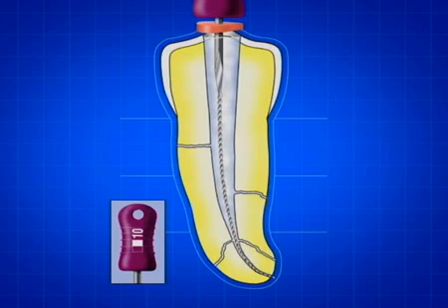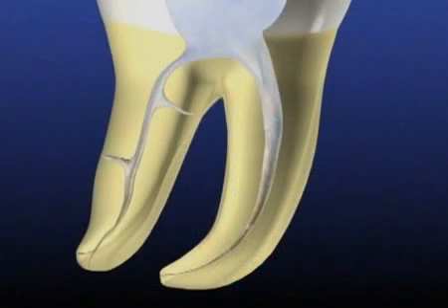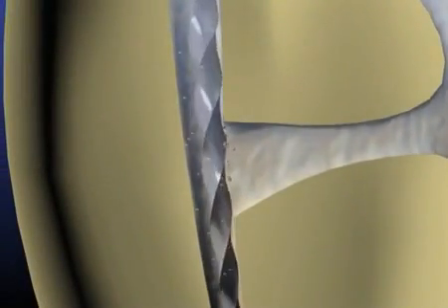Once we have negotiated the canal to its terminus and established patency, then generally it is quite straightforward to shape the apical 1/3 and smoothly blend this portion of the preparation into the upper 2/3. Most clinicians associate a block with an apically obstructed canal. However, lateral anatomy is also frequently blocked, especially when using radial-landed instruments.